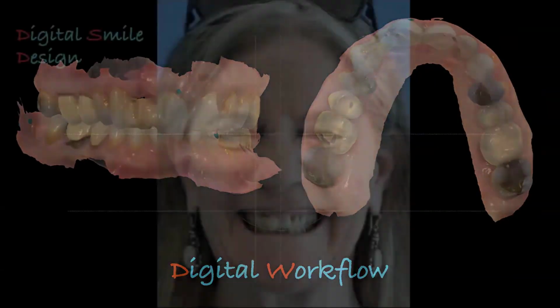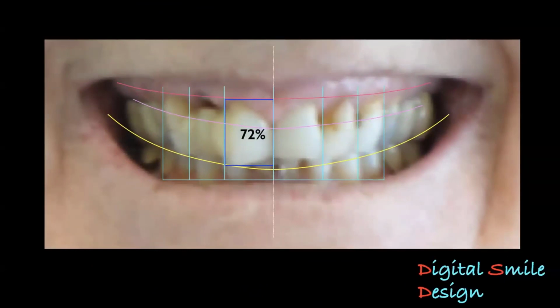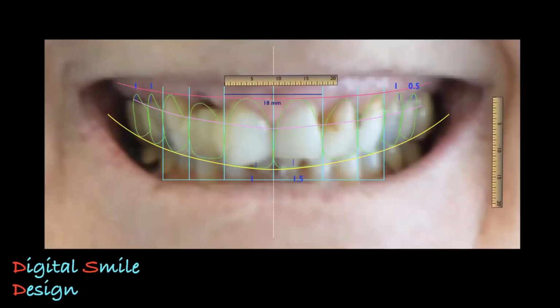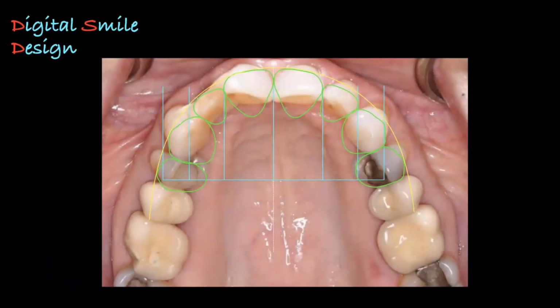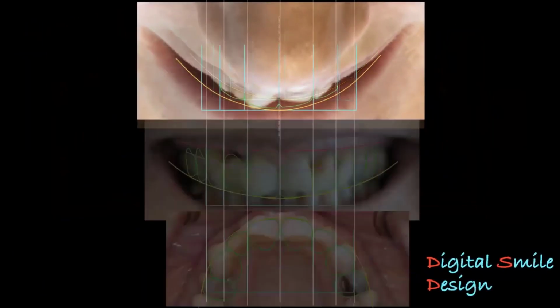We can see that there's an area where an implant has been placed, and we're looking to say, okay, well, where is our smile design going to be? We can take our smile, and you can see it's blurry because it's taken from a snapshot of a video, just to get the perfect image to line things up. We communicate to our patients using digital technology: what are the size of the teeth? What are the size of the crowns? How are things going to look? And at that point, using a bird's eye view, we line it up and spend the time to say, hey, listen, this is what we think based on your bone, your tissues, everything, your smile design. This is a two-dimensional rendering of what we think the teeth should look like.